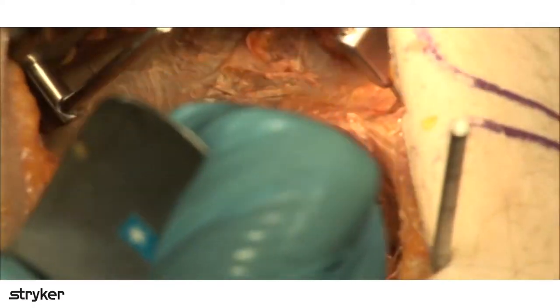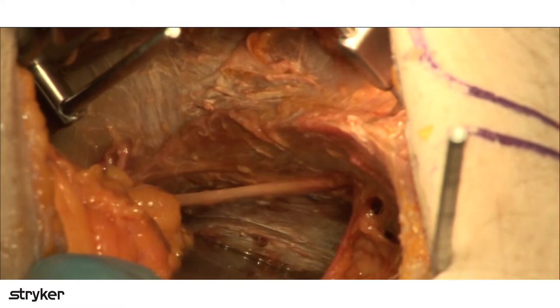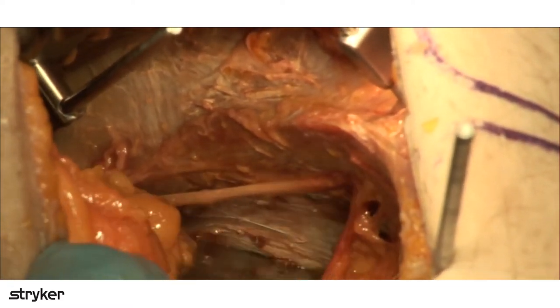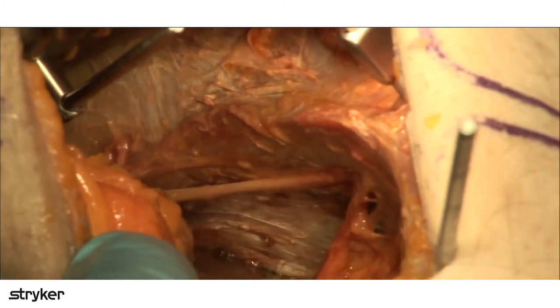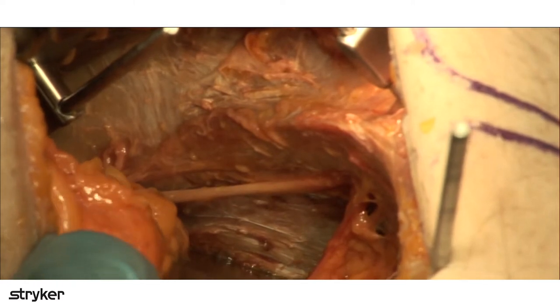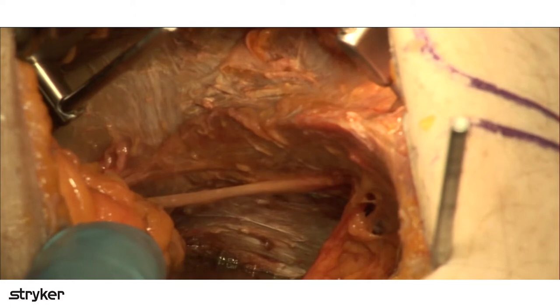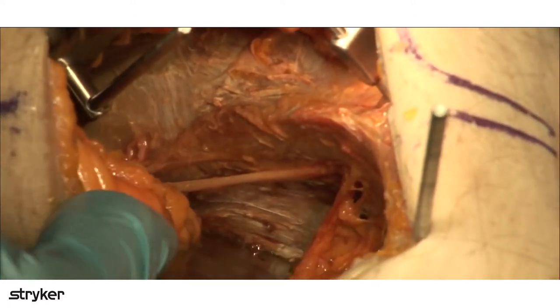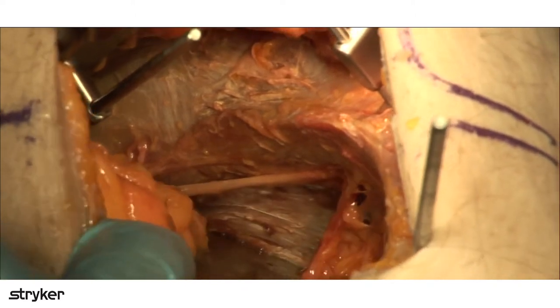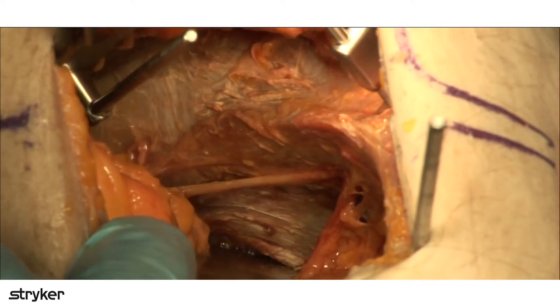All right, and what's happening here now is I'm in the greater notch there. Now, people get a little worried about the greater notch, and you should be. You've got to be careful when you go in here because you've got the superior gluteal nerve and artery. But the other thing that you really have to remember is that the hip is flexed, and when the hip is flexed, the sciatic nerve is under a little bit of tension. So that's just how you get sciatic nerve palsies when you do an anterior approach. That was a paper written by Heidekevich many, many years ago. It was more for ilioinguinals, but it's still applicable here.